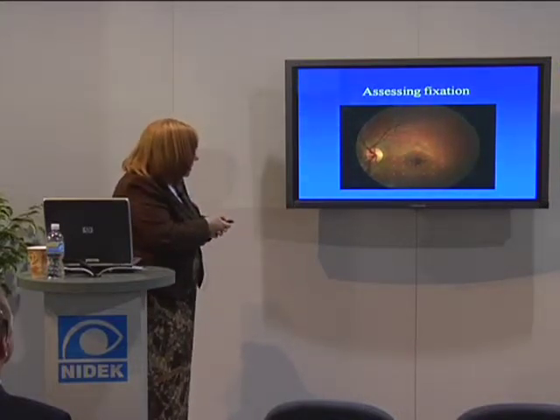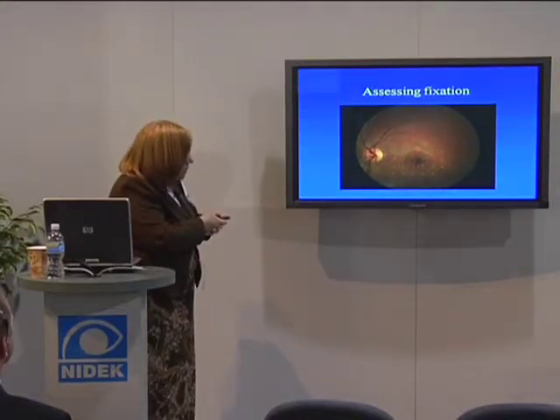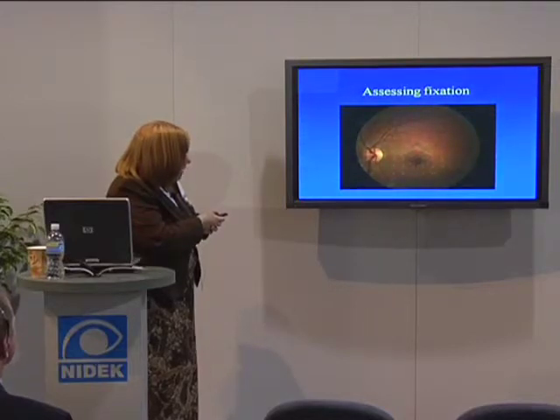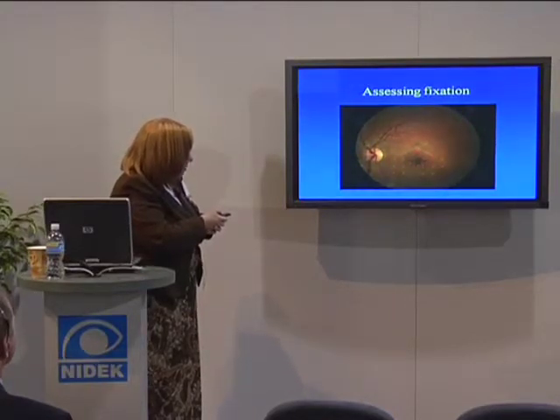And this is a patient with Stargardt disease. You can see the flecks here. There's an area here of dense scotoma, and the patient really has quite stable fixation up here.